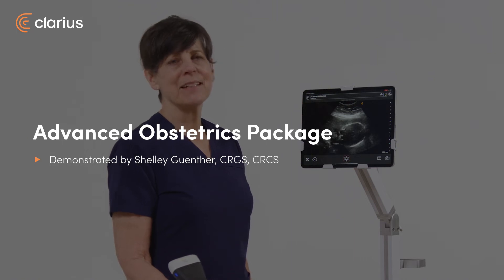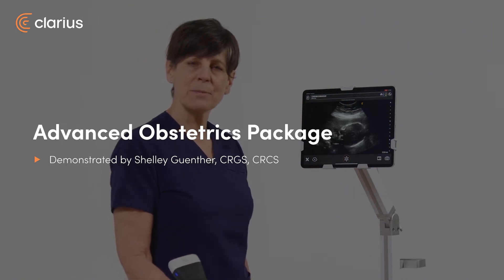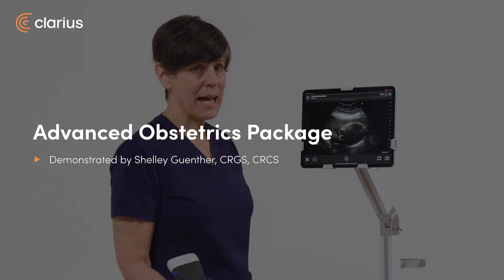Hi, my name is Shelley and today I'm going to show you the advanced obstetrical package on the newest Clarius app.